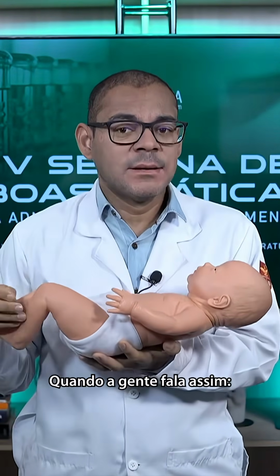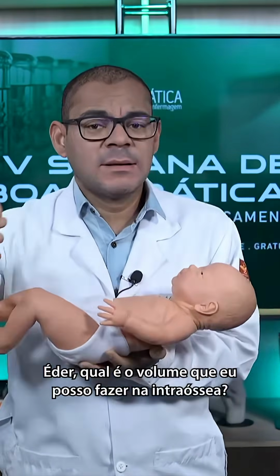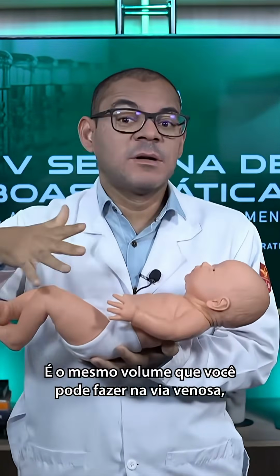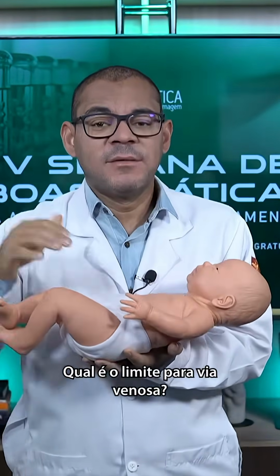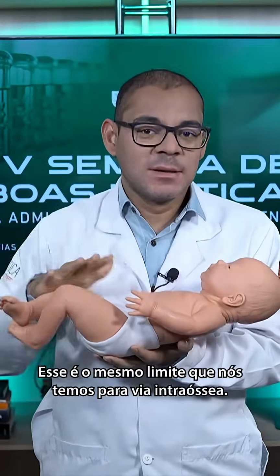When we talk like this, Eder, what is the volume I can use in the intraosseous route? It's the same volume you can use in the intravenous route. In other words, there is no limit. What is the limit for the intravenous route? That's the same limit we have for the intraosseous route.